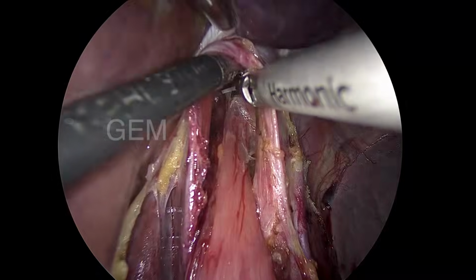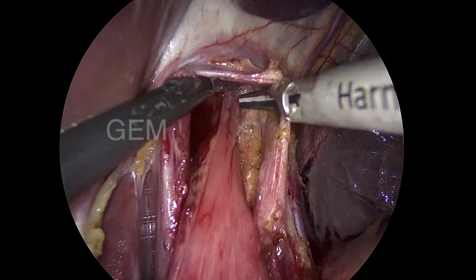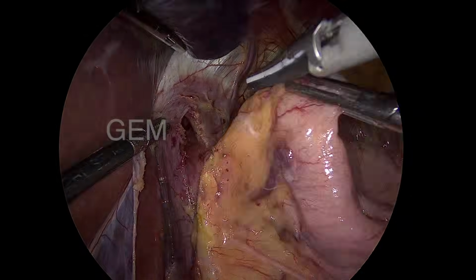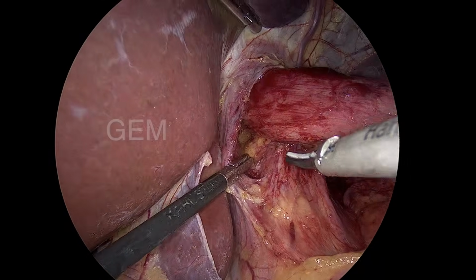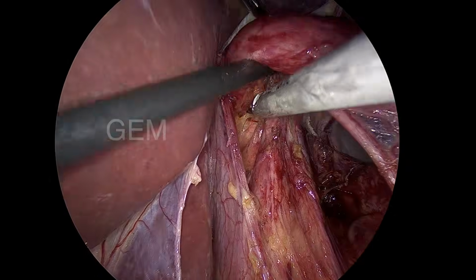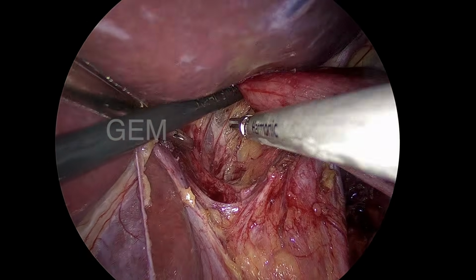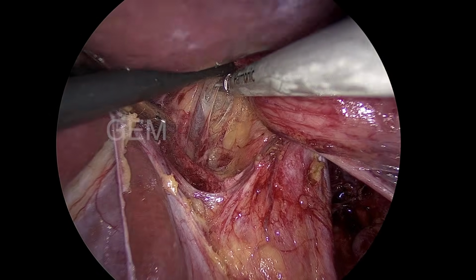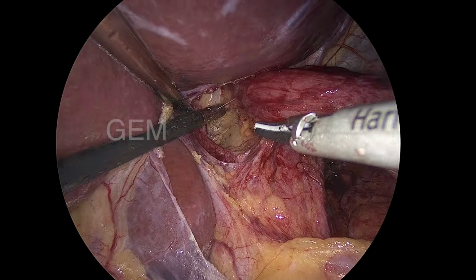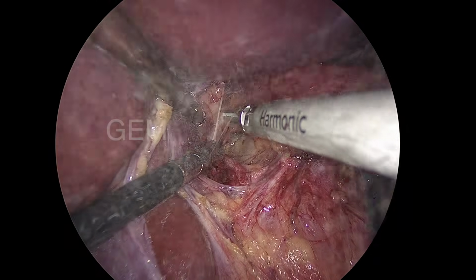Always be careful about the vagus now, and all the vagus has to be preserved. Otherwise, it may lead to some gastroparesis postoperatively, particularly the anterior vagus, that is a motor function. So here I am trying to straighten the esophagus, dissecting the right side and posterior, and you can see my liver retractor is entering into the hiatus, retracting the right lobe of the liver, so that the mediastinum is exposed nicely.